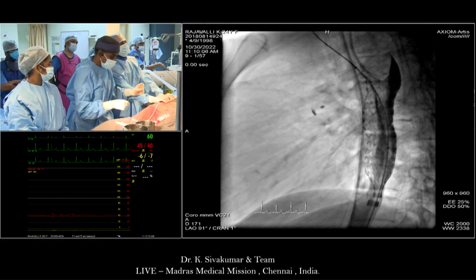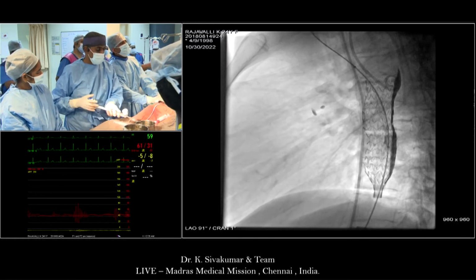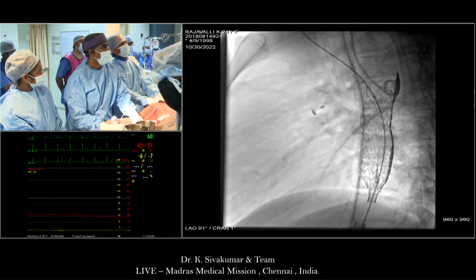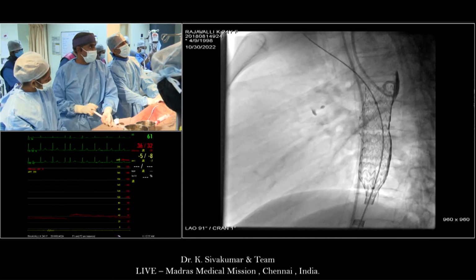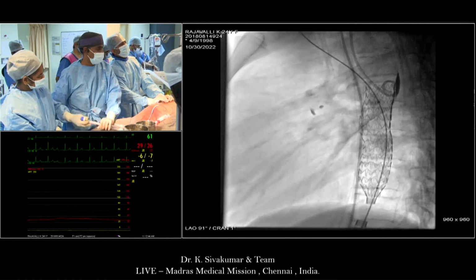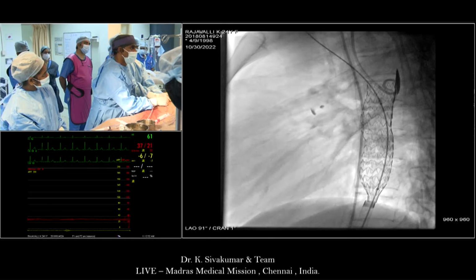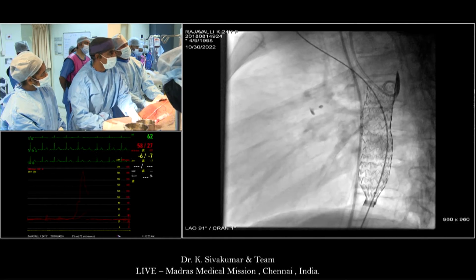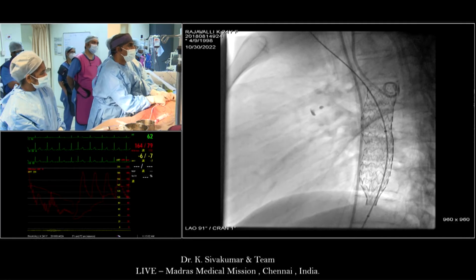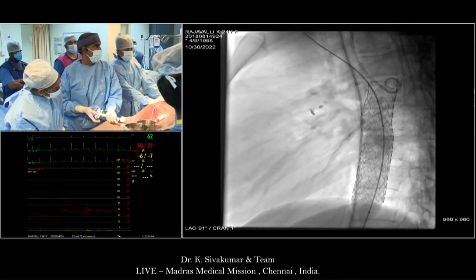Okay. Probably, see the proximal end, the distal end, I have to inflate because it's a covered stent. At this point, I will inflate. This is the challenge of not having an 8 centimeter stent. I'll keep it there. 8 centimeter balloon. So I'm coming below. Okay.